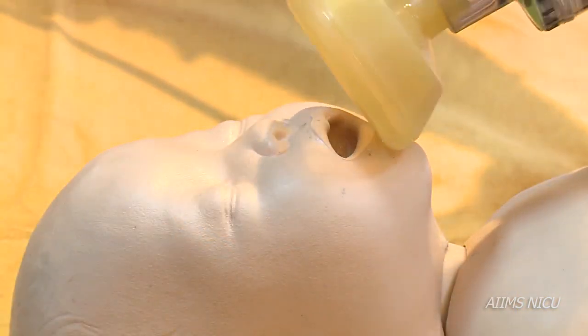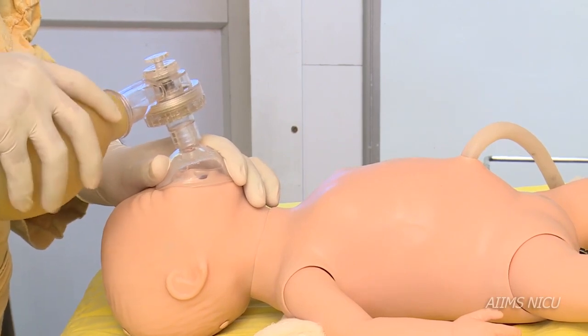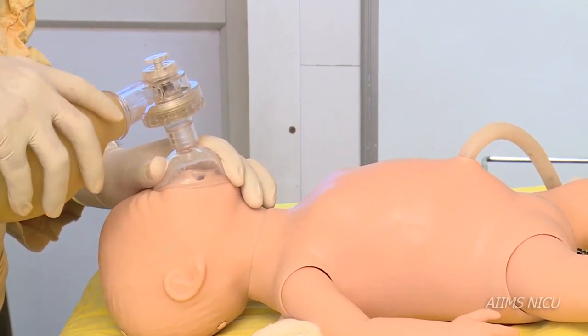The mask should snugly cover the baby's nose and mouth, covering the baby from the bridge of the nose to the chin. It is important to achieve a tight seal for effective bag and mask ventilation.